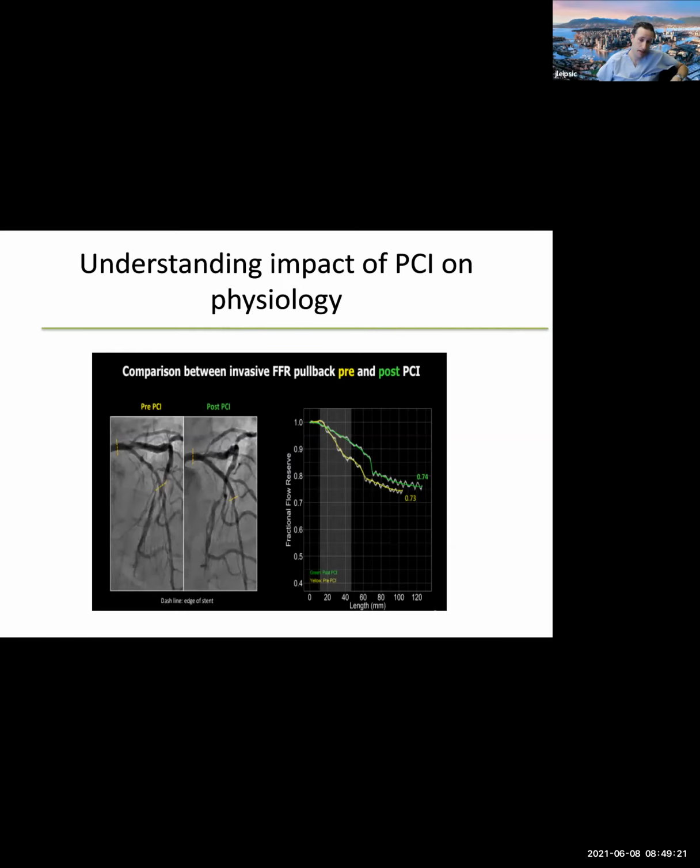And that is something that I think we've struggled with because we don't have good nomograms for CTA as to when is it early. We published a nomogram from CONFIRM back in Circulation: Cardiovascular Imaging in 2016. But beyond that, I think we can look at the calcium score if we have it to provide us an assessment of whether the plaque is premature or not. I don't know if I answered your question, but these are the sorts of things that we need to start really emphasizing, right? What's the most severe lesion? Is there adverse plaque? How extensive is the plaque? Where is the plaque? And do we think the plaque is premature?